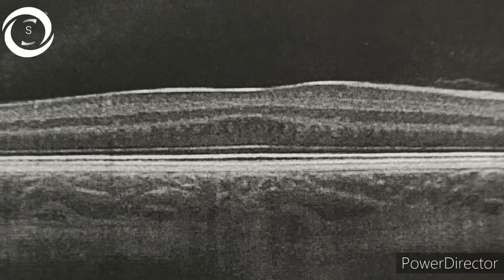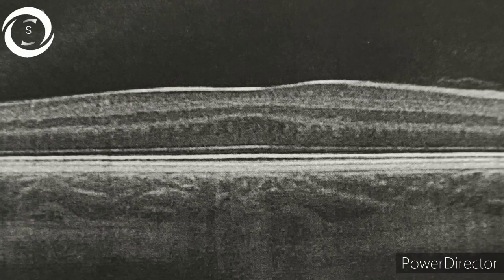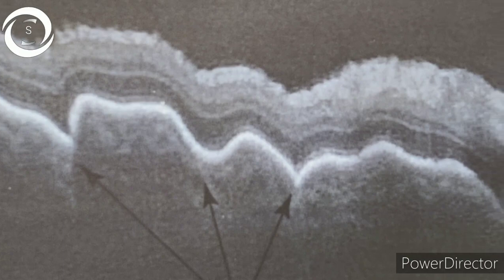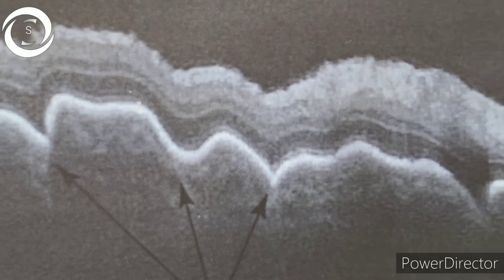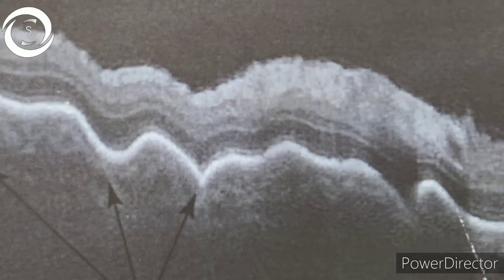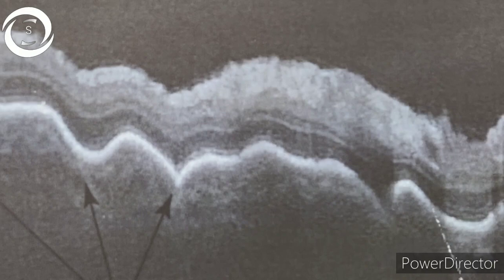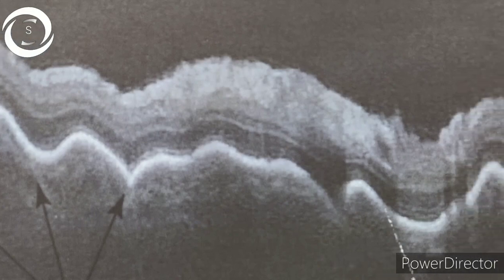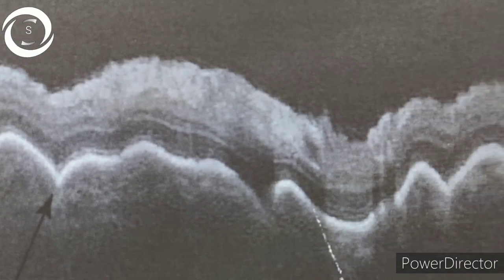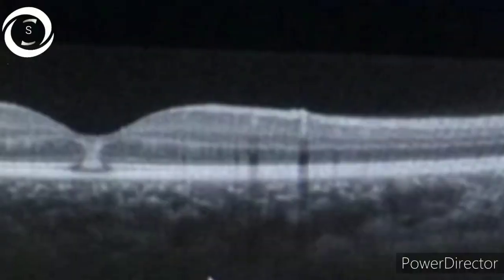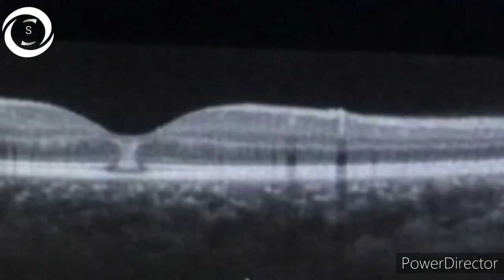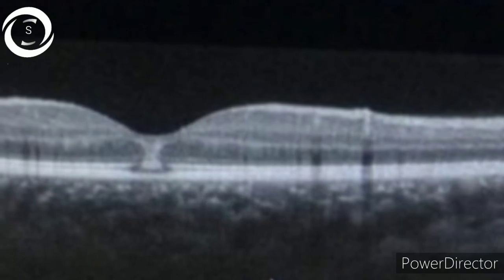In the tenth OCT, you can see a regular wave-like pattern of the RPE, which shows chorioretinal folds in a posterior scleritis patient.